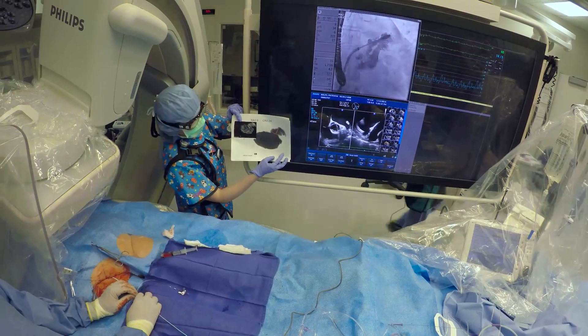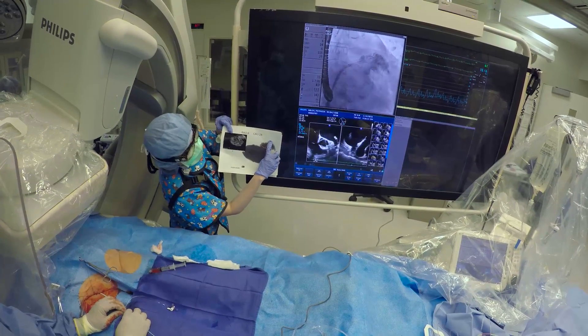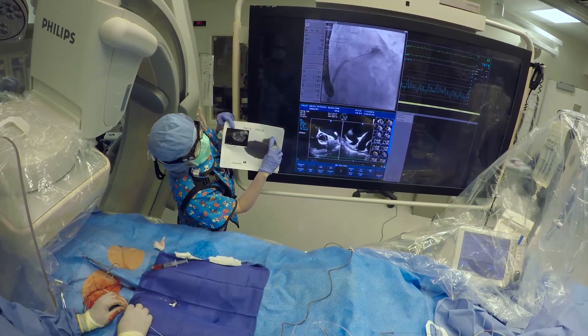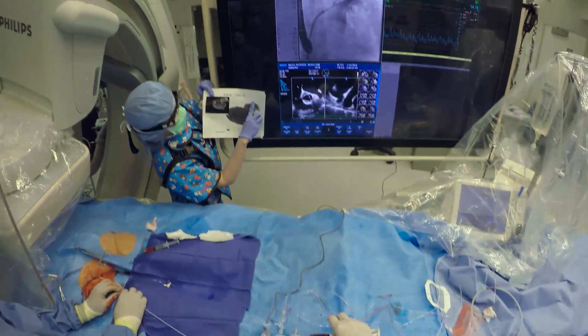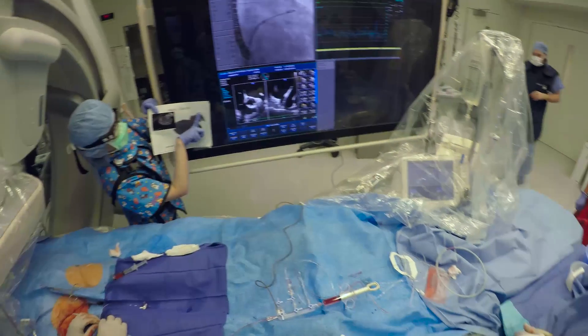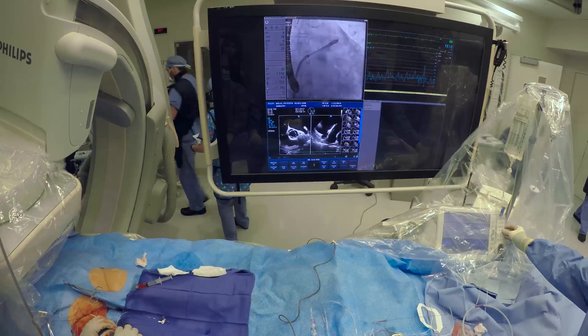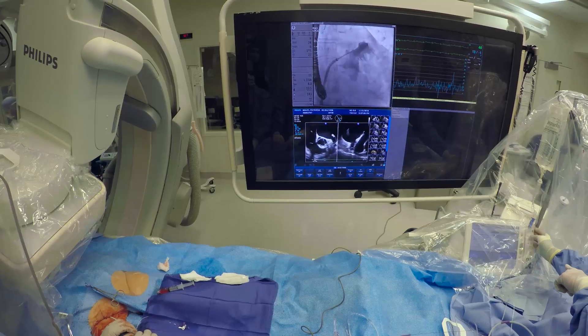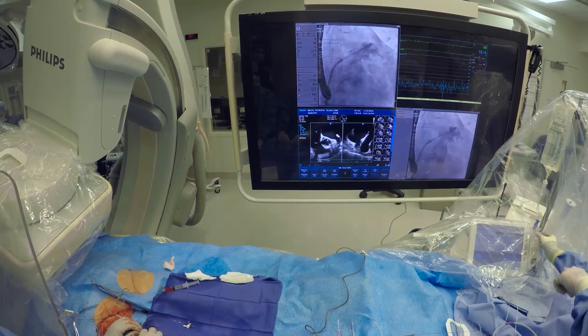Dr. Wang has an angiographic position that she's modeled on our 3D model and you can see that we know the exact radiographic image. She's pointing to the tip of the appendage where we're going to want to be pointing the delivery catheter. We have the exact angle in this patient — it looks like it's a steep caudal with sort of an AP projection, but this is all decided ahead of time, so it's really very easy for us to position.